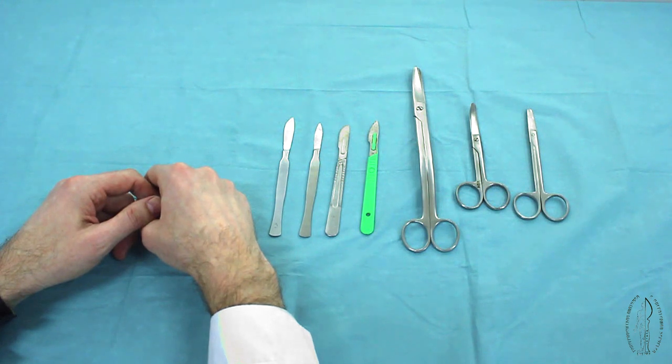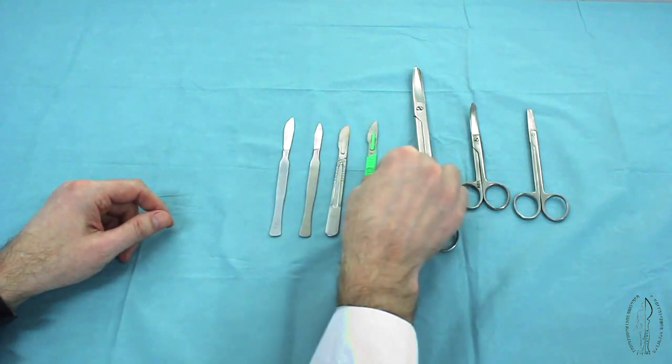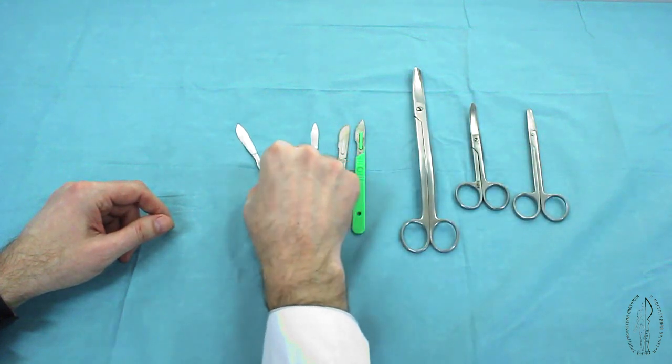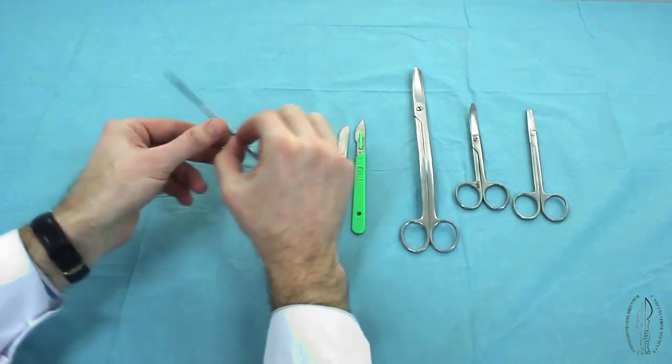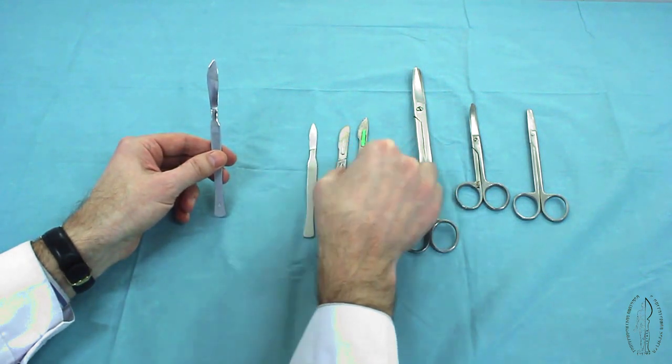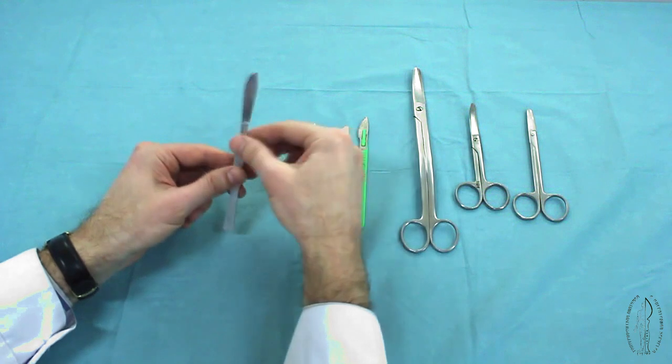The instruments for disconnection of tissues include scalpels and scissors. By shape of the blade, scalpels are divided into bellied, with an arc-shaped cutting surface, and sharp-pointed.